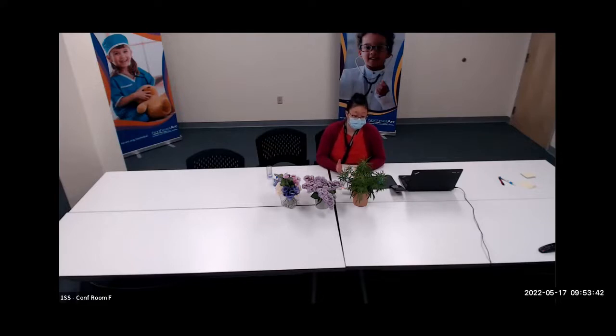So it's a good idea to have a spare at home. If you don't have a spare at home, I would recommend just wiping it, if you have a barely damp washcloth, just wipe the secretions out if you don't have a spare.